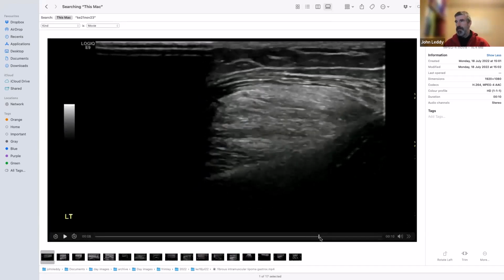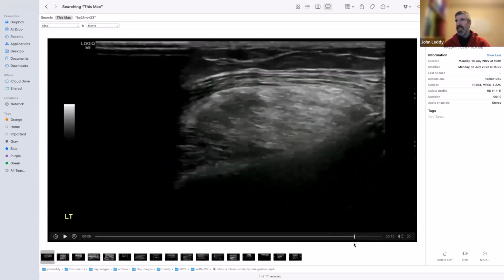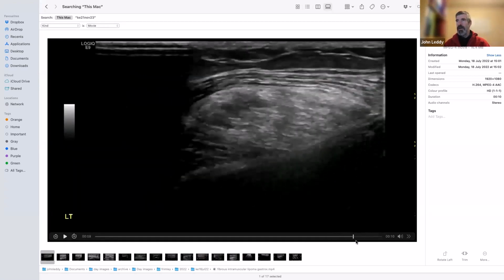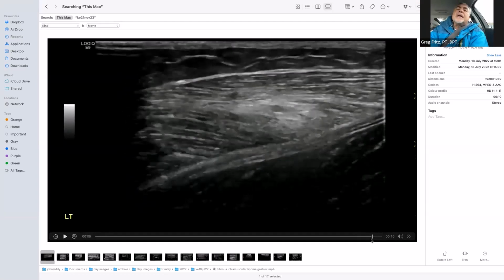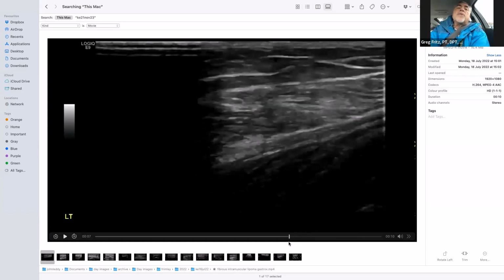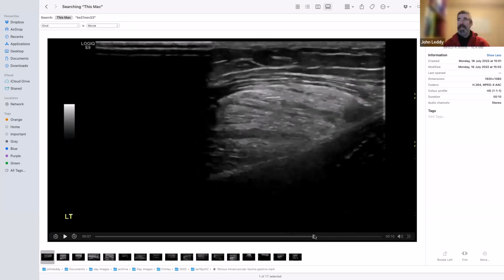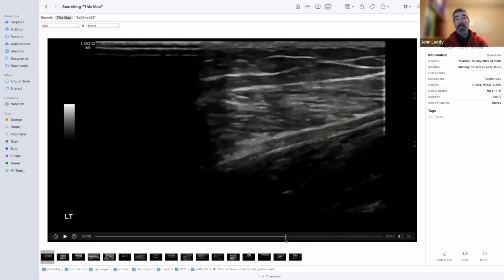It doesn't make them any more or less likely to be anything unpleasant, but it looks so like muscle, like all the muscle around it. And actually, the fibers don't join up with muscle, which is what tells you that it's not just part of the muscle. Are you feeling that this is not a remodeling or degradation of muscle, but an actual growth of its own collagen? Yes, when these get taken out, and they do routinely, they are lipomas, so basically fatty lumps with a fibrous component.